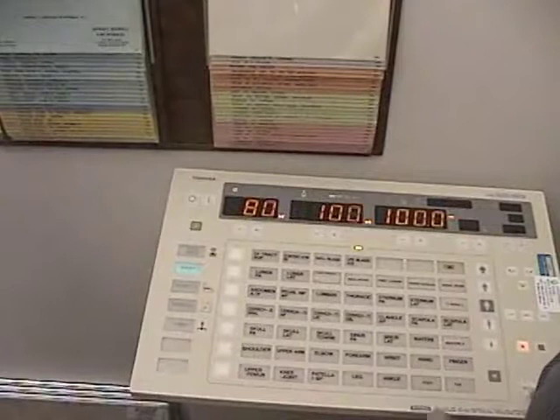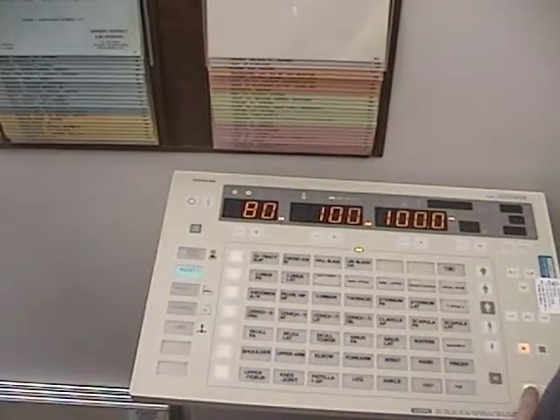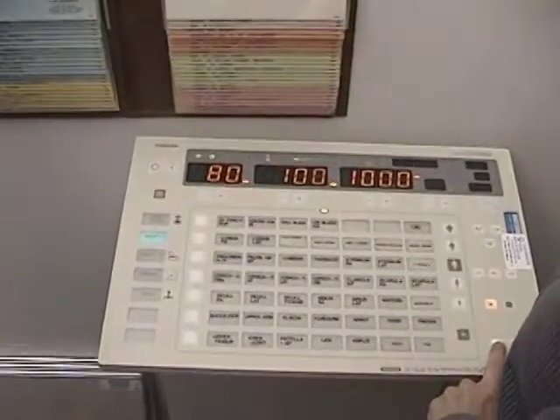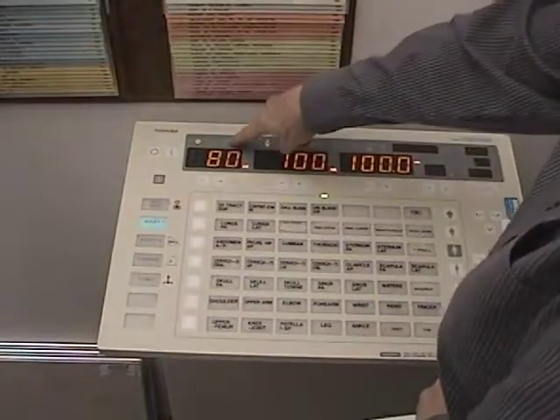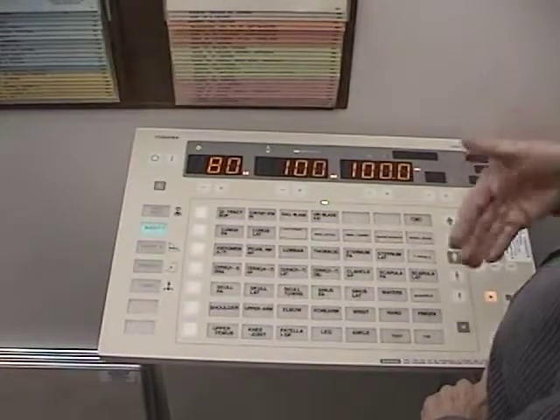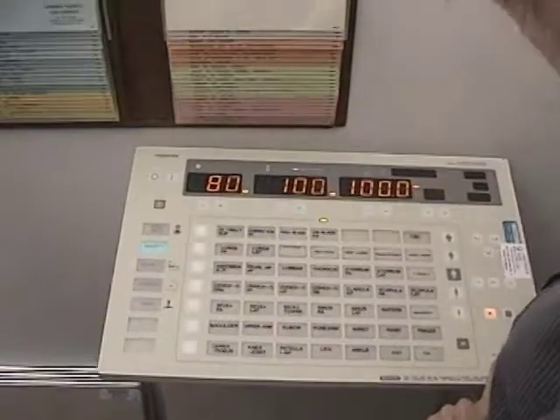The other thing that you're going to do is push your ready. Here it comes to full speed, and then when you push your exposure button, I want you to notice the length of the exposure time. And you notice two things. We had an indicator of X-ray on, and it stayed there until the exposure was over. It's the timer that stops the exposure.